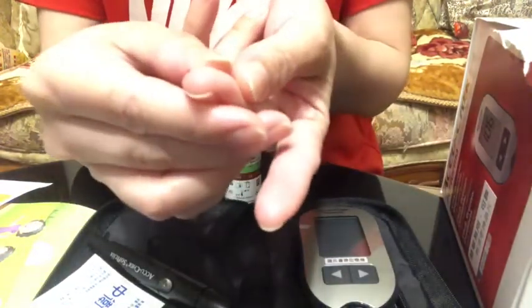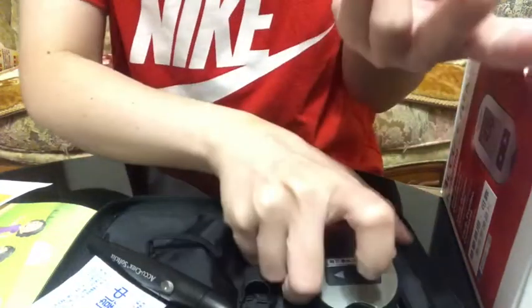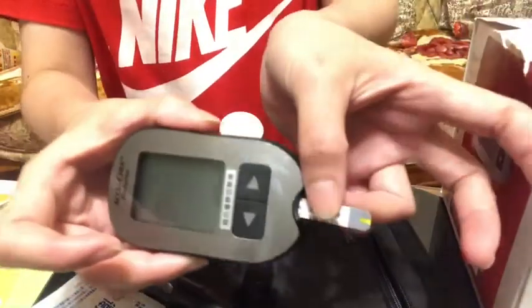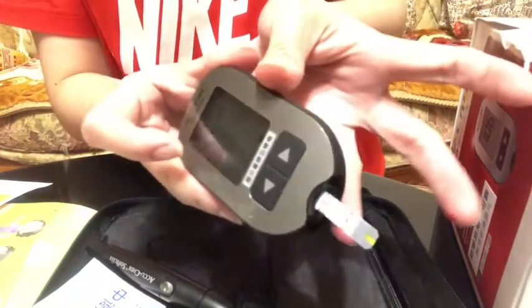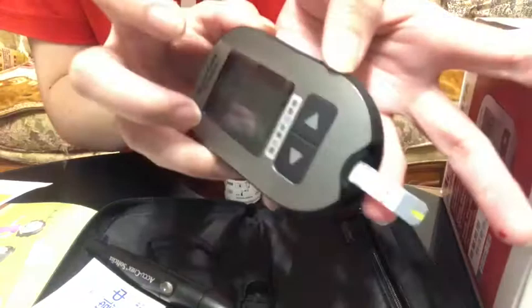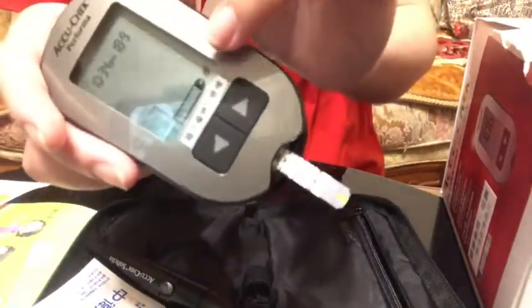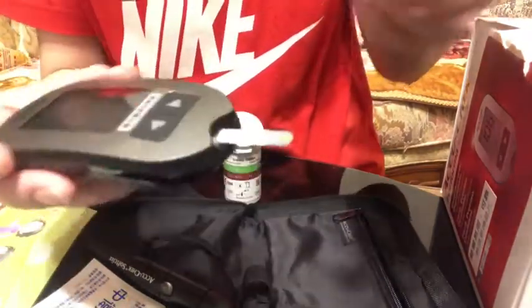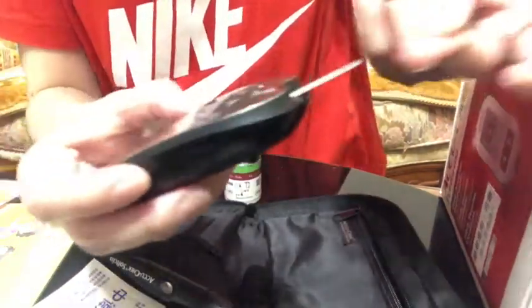Squeeze a little. If you see this, it means the device is ready to drop blood.